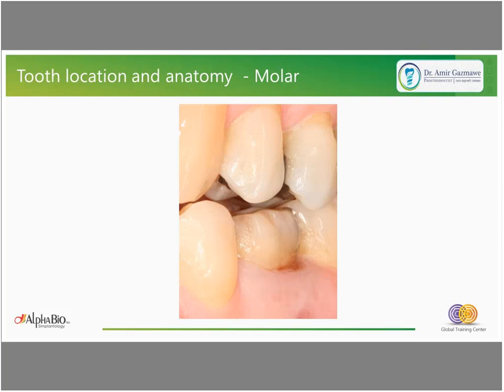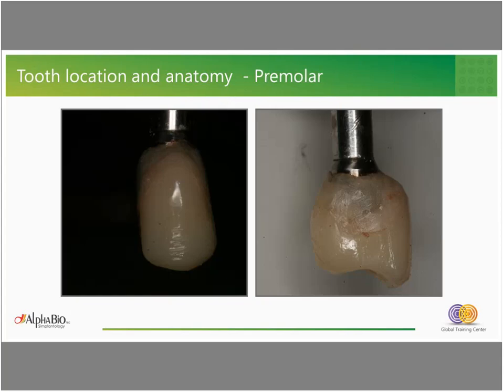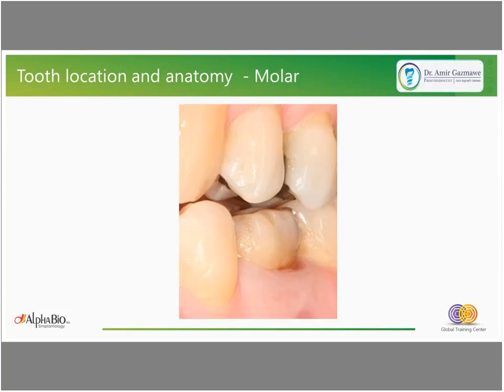The first case, it's actually a small case of restoring deciduous tooth that was not replaced by permanent tooth, and you can see that we have impacted tooth, and we can see that we have missing molar.